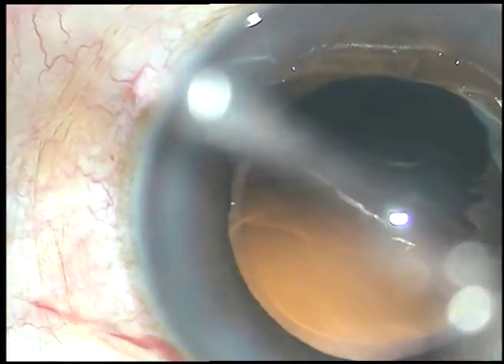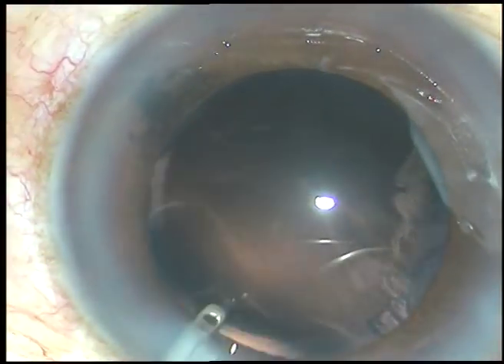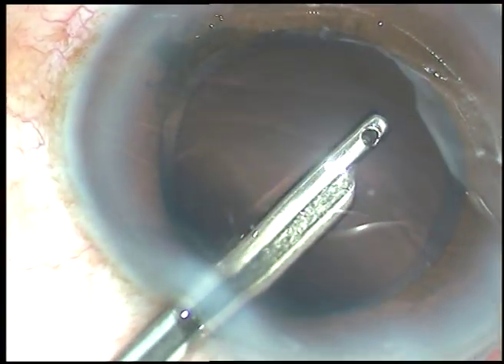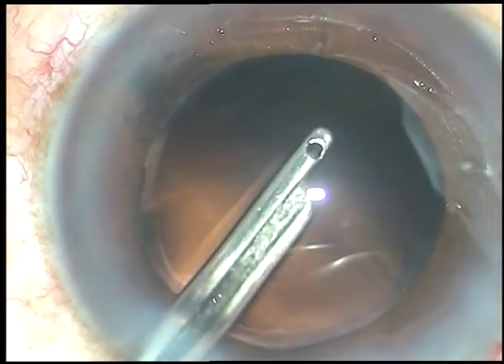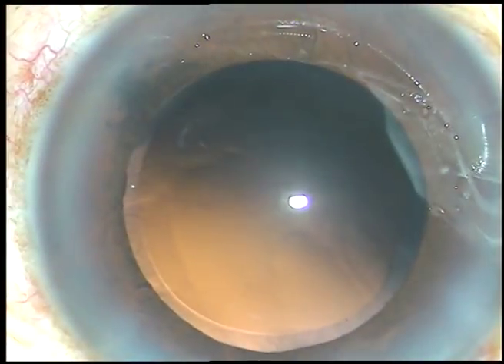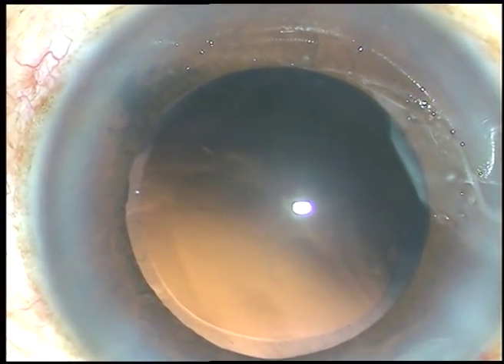And that time is enough. Now go through the side port and remove the cortex from 10 o'clock and 9 o'clock, and cortical clean-up is done. In this case, the posterior capsule is very clean and there are no cells on the posterior capsule.